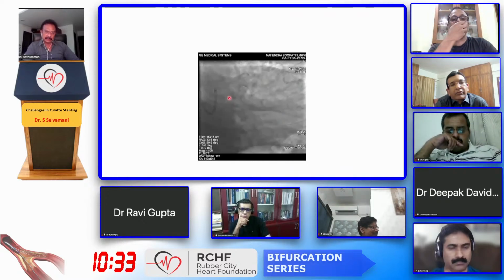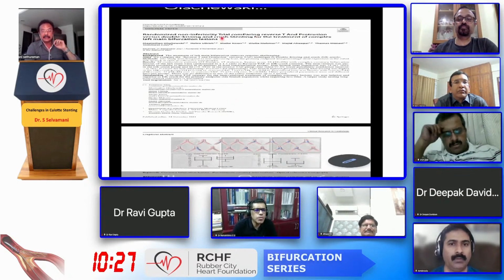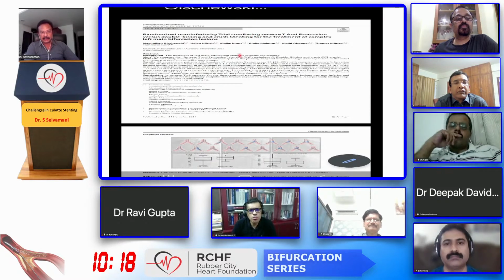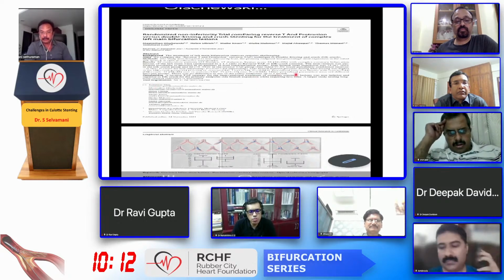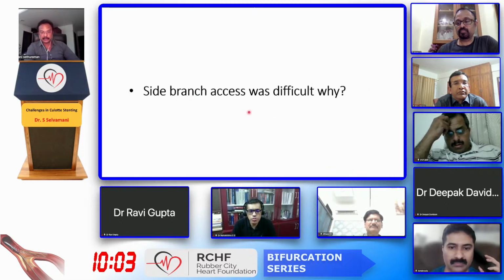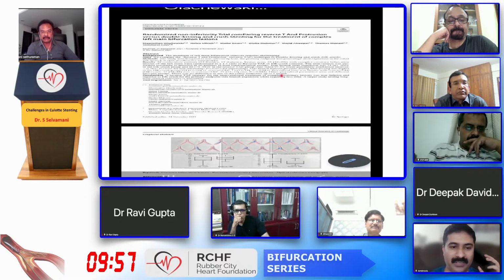So why this? We call it something like a reverse T, because I came across a paper and after that I have done a few cases where, in comparison with even DK crush or whatever technique, when you use this reverse T and protrusion, you get better results, or it has been shown to be slightly superior to DK crush also. But it's a very small paper which was published recently in November 2021. And my experience is also showing it to be quite good with this technique. And even electively, we are doing some cases of reverse T and protrusion. And we have an OCT follow-up probably, which we can discuss in some other meeting.